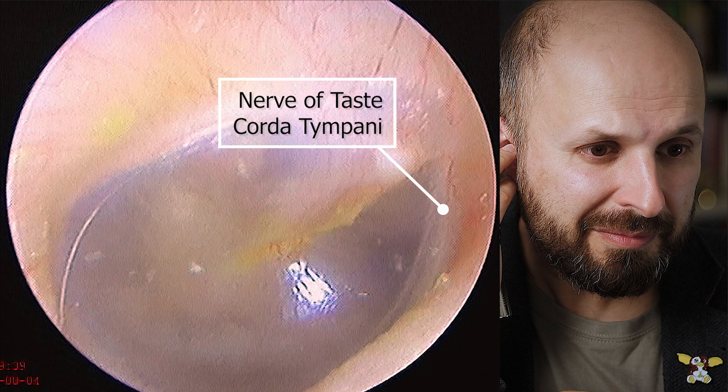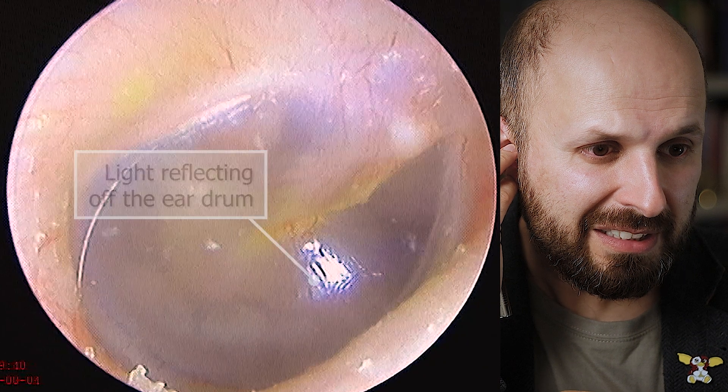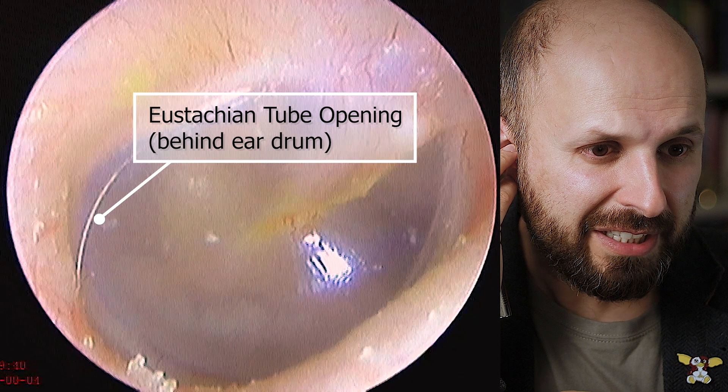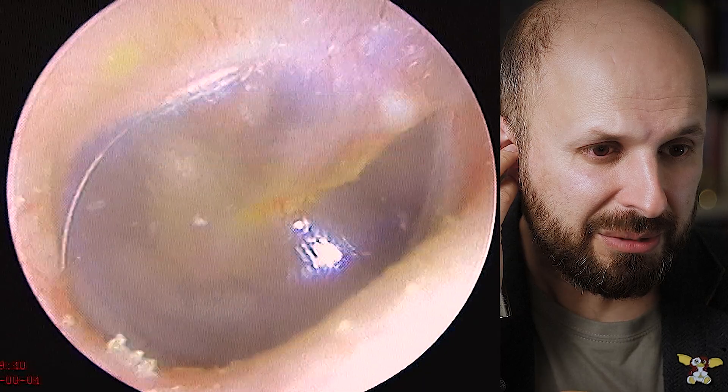Just under here you'll see the nerve of taste that goes to the right side of my tongue, and that bright white area is just light reflecting off my eardrum. That dark area you can see behind the eardrum is where the eustachian tube opens up. That tube runs from behind the eardrum to the back of the nose — it's how you pop your ears when you're in an aeroplane.